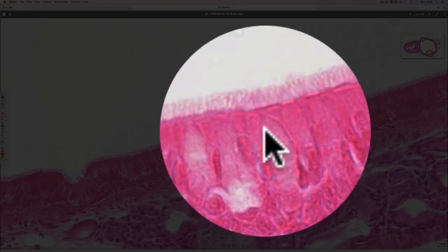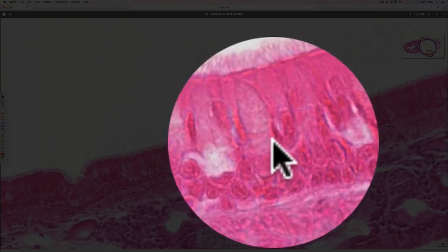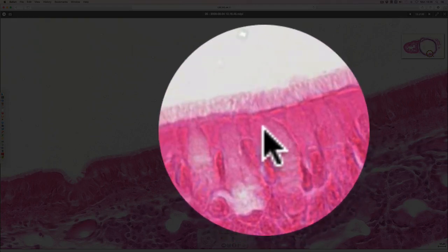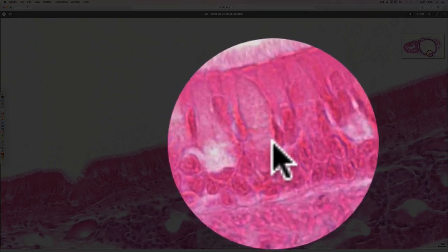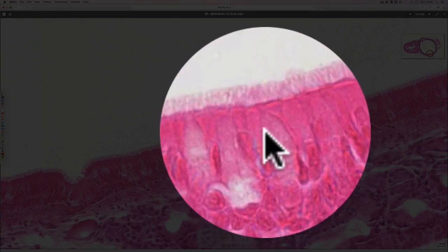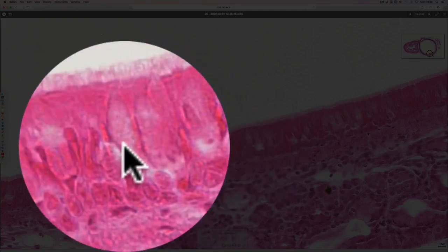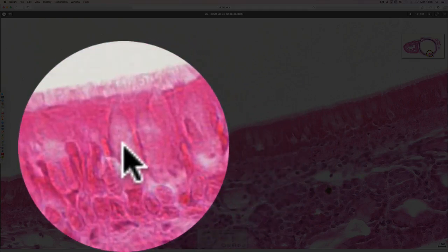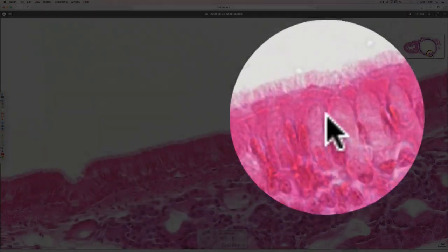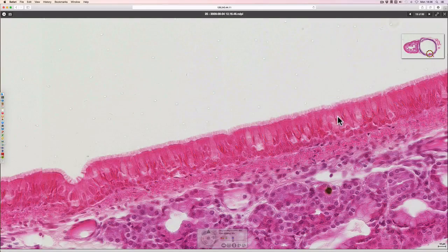There are also cells which secrete mucus — these are goblet cells. You can see one just here, and one over here. There are a number of them that secrete the mucus which traps the particulate matter.